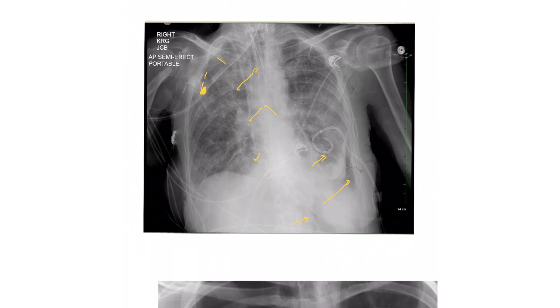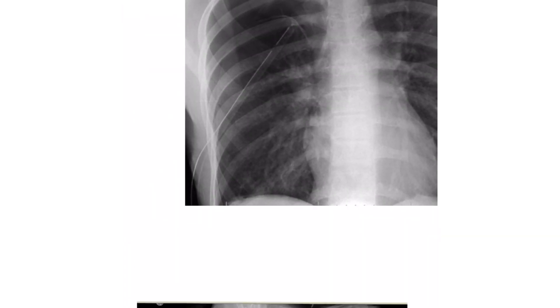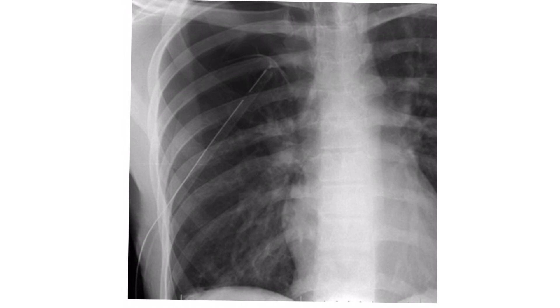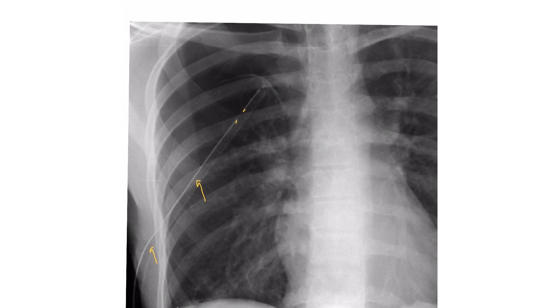Here is one more example. You can see a chest tube coming in right here. There appears to be a gap — those are the fenestrations or holes in the chest tube. The key thing you need to know is that these holes must be inside the chest; if they are outside the chest they will cause an air leak and problems. This is a standard chest tube — they are thinner compared to the regular blue pleural drains or pigtail catheters.